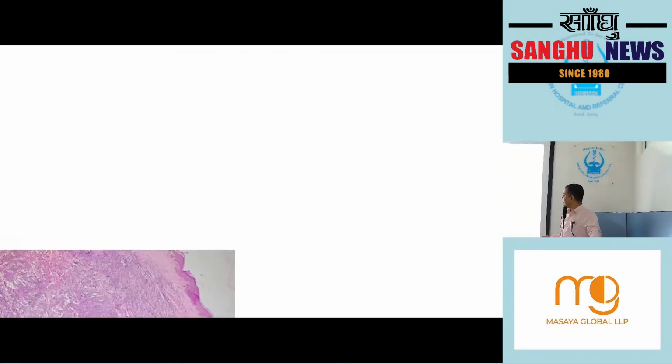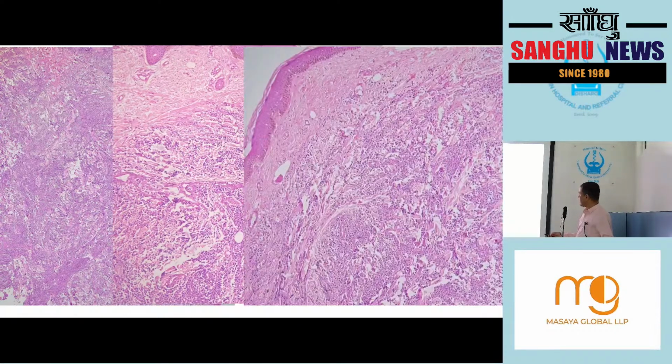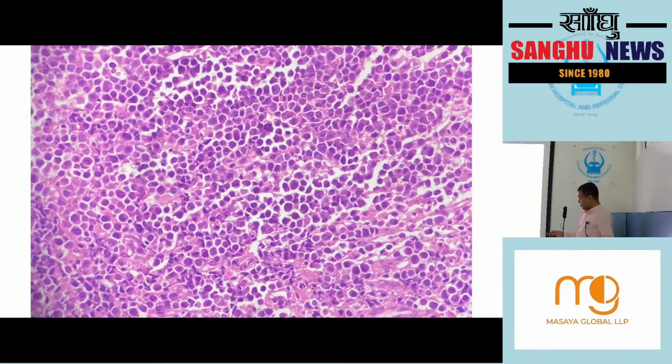An incisional biopsy was done. This is what I received. You see the epidermis and this infiltrate-free zone beneath the epidermis. The infiltrate is mainly in the dermis. Here also the same thing; this area is free of infiltrate. This is a little bit closer view.